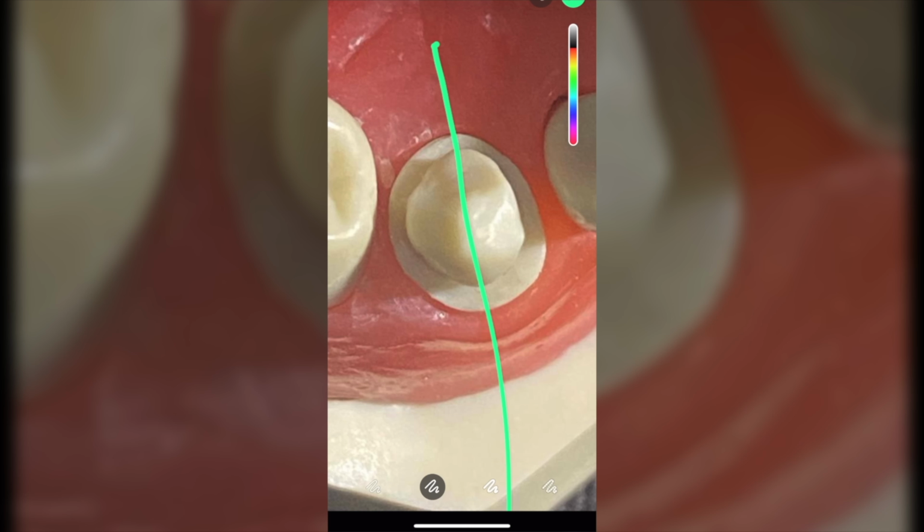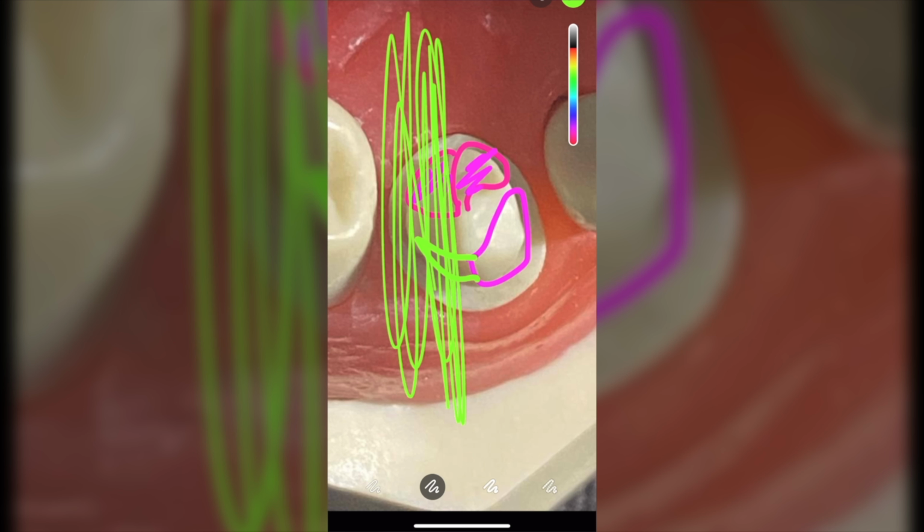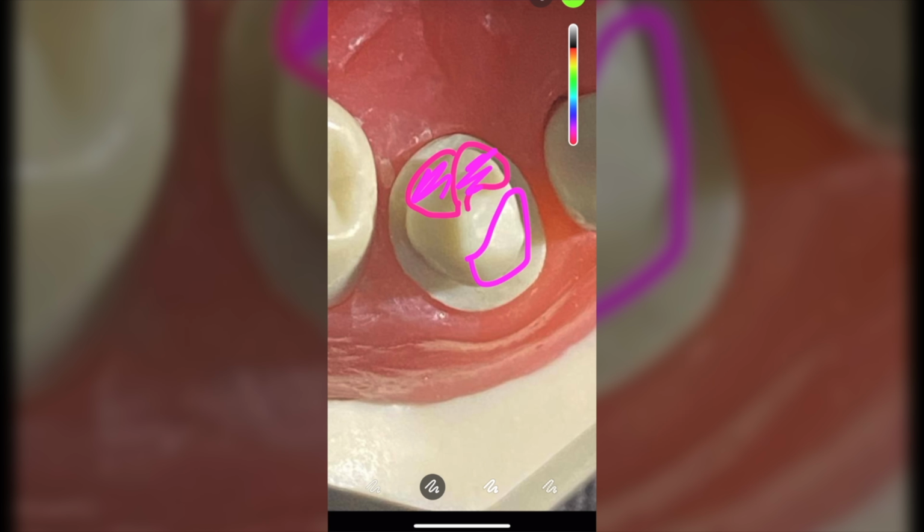Look at this. Divide the prep. Look at the reduction here. Look at the reduction here. Can you see there's a difference? Can you start to see the difference? This side is less, this side is more. This side is coming to here and this side is coming to here. That means that was the side you were covering with the putty and you were focusing so much on the putty that your measurement is completely wrong on this side and right on one side, or completely opposite, vice versa. It's not matching. Can you see the difference?